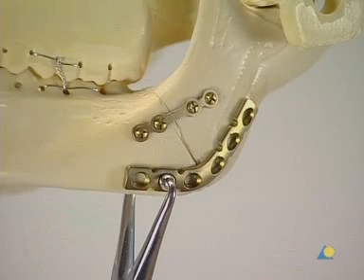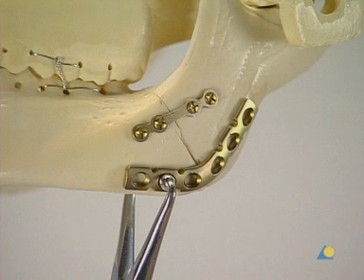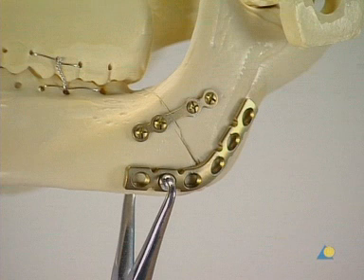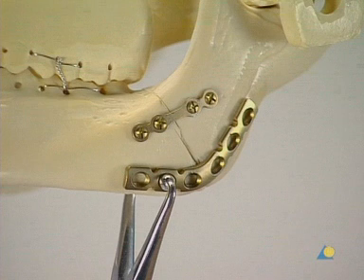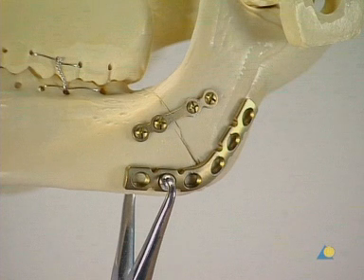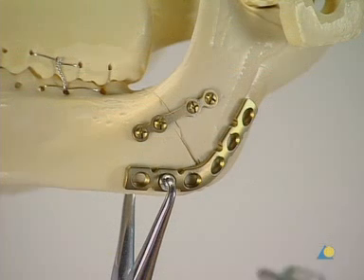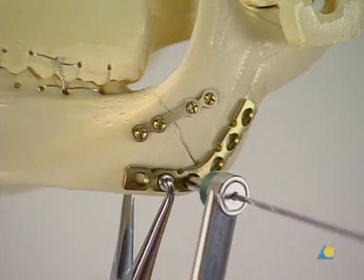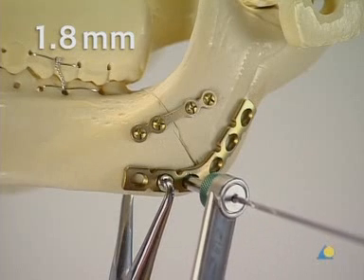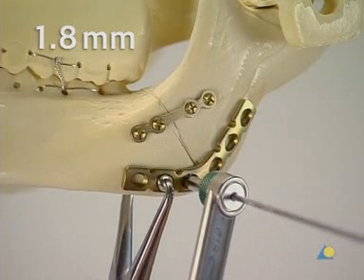If the surgical approach is external, the contoured plate is held in place by using the plate-holding forceps. Since this plate is used as a neutralization plate, no compression is needed. Therefore, the green neutral drill guide is selected to drill a 1.8 millimeter bicortical neutral hole.